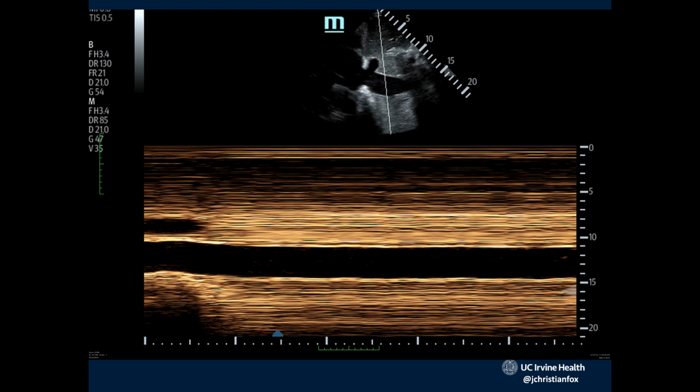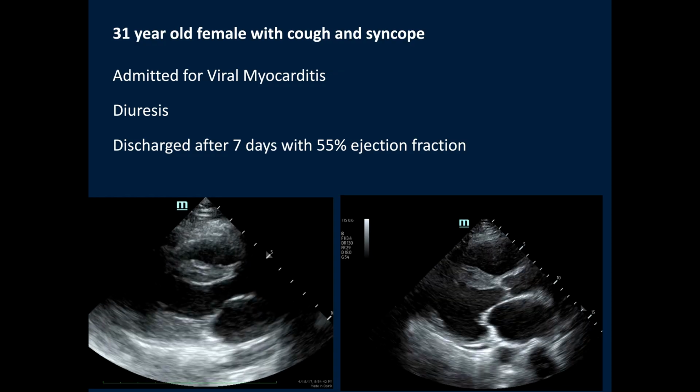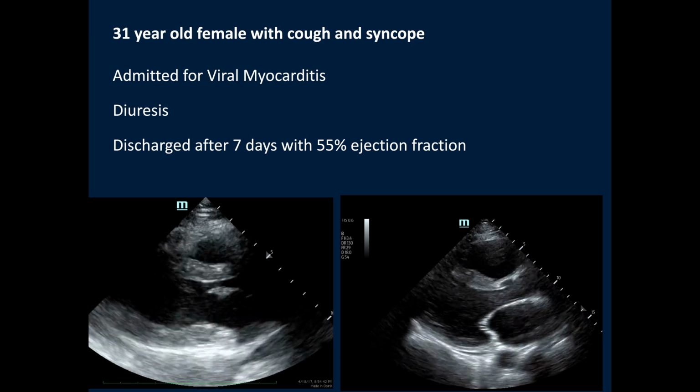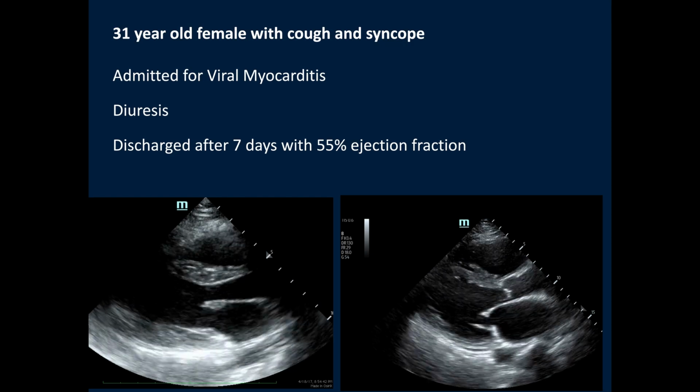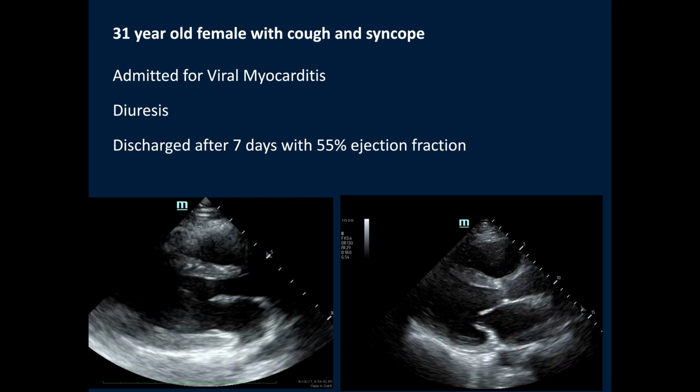We start her on some steroids. We also look at her IVC here, and we can see her IVC is pretty plump. It's got no respiratory collapsibility, and so we know that fluids-wise, we're pretty well resuscitated on this patient. So she got admitted. She got some diuresis, actually, for that low EF, the pitting edema, and the very full IVC. And she got some steroids for the myocarditis.